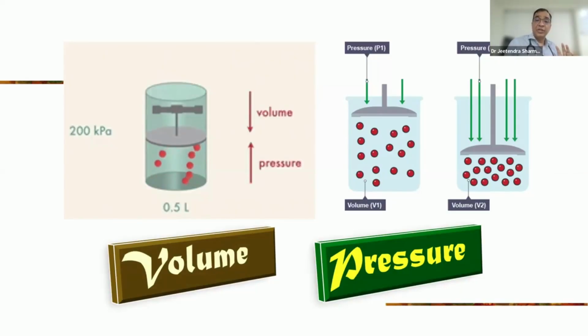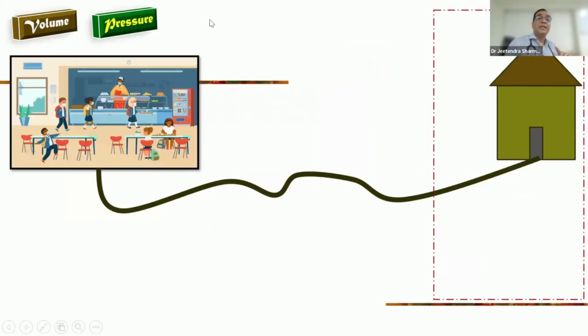So what we are doing now, we are keeping the volume one thing and the pressure one thing. And the next thing is how the ventilation is started; based upon that, we understand the different modes. So everybody must be clear at this point. Either we can deliver a breath by the measurement of pressure or volume. So either or. Okay. Now further, how can we understand the mode?